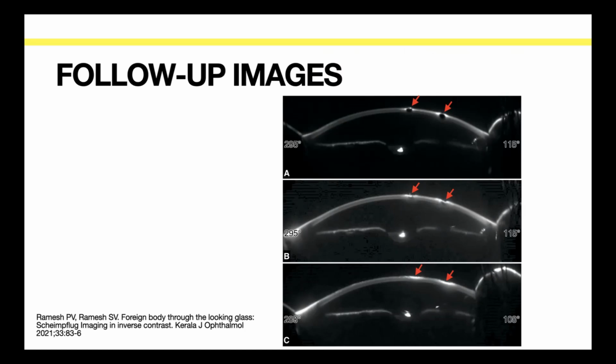Again, this is another simple, trivial case of a foreign body removal. We just wanted to see how it really heals the epithelium and the stroma from a Scheimpflug point of view. The prompts can be given in such a way that each image has to be aligned. So you have to tell the machine to align each one of them when you make a collage. You can do it manually, but these are some simple things where we can use AI.